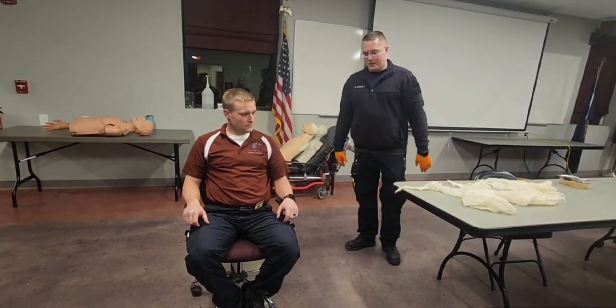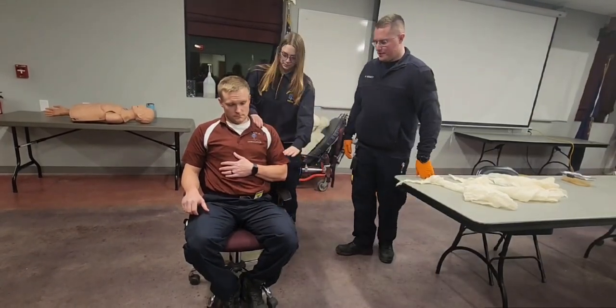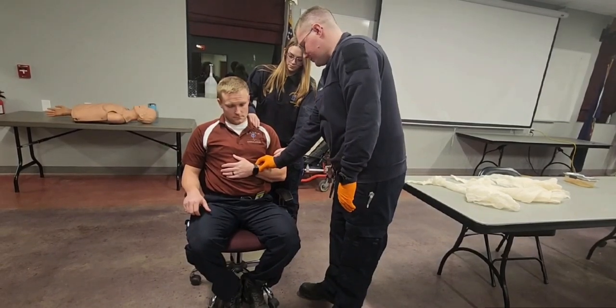I'll start by having my PPE on. I'm going to have my partner come and hold manual stabilization above and below the injury. I'm going to assess motor, sensory, and circulatory functions.